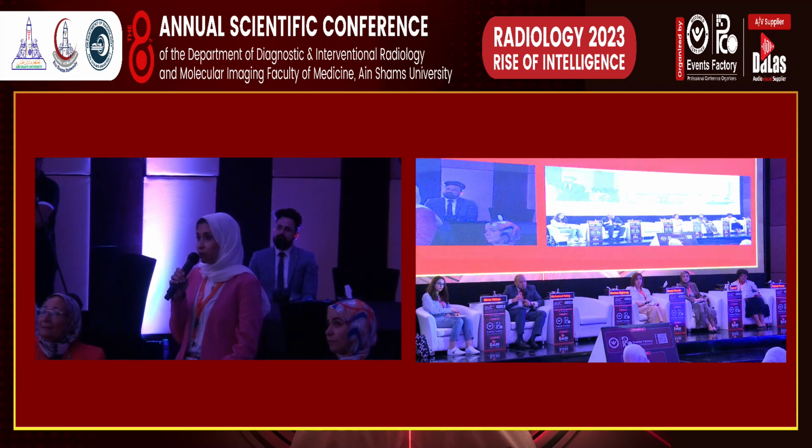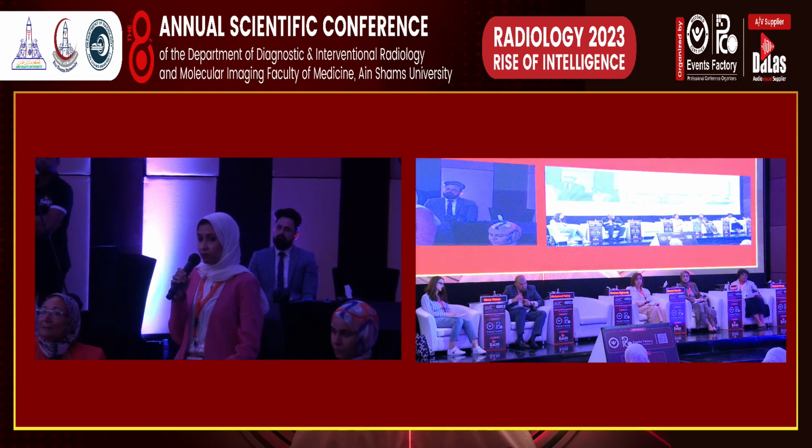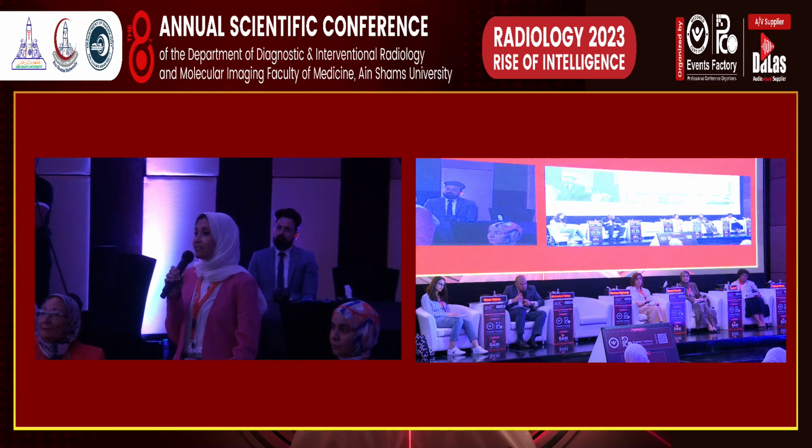طب ما عرفتش بعد كل دوت، لازم احنا عندنا في الوحده مثلا العيان ما بيتحركش من الوحده غير لما نبص على الفحص. لازم حد من المدرسين المساعدين او المدرسين يبص على الفحص ويتاكد ان هو تمام وان هو مش محتاج حاجه كومبلمنتري ايمجز ثانيه للعيان.